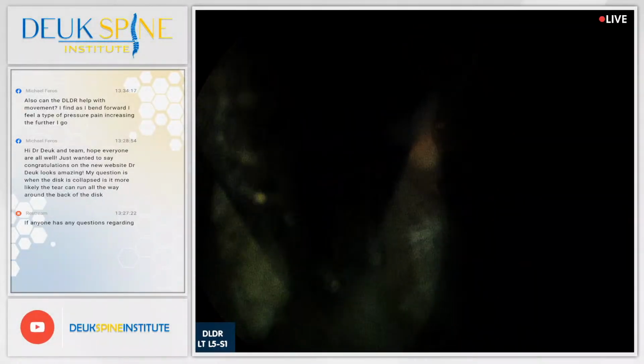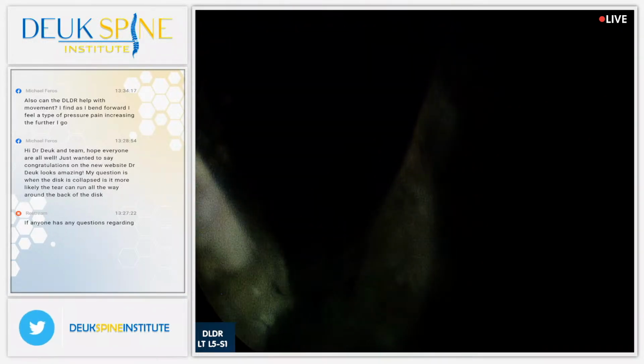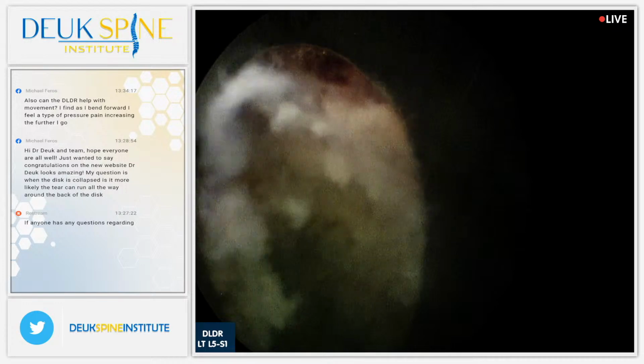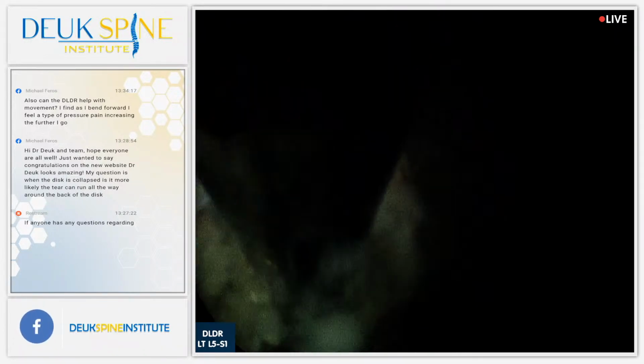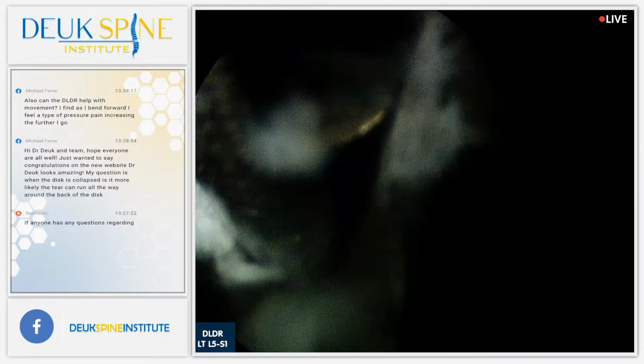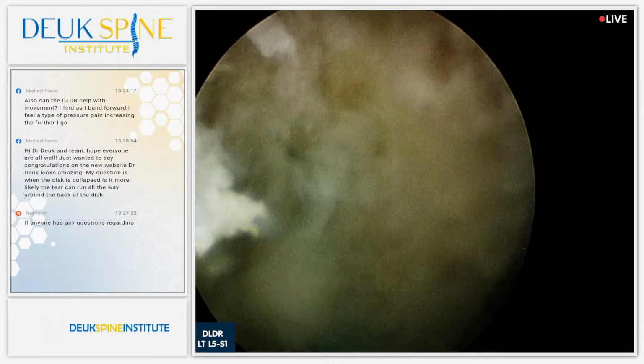All right, well, you show the audience the facet animation. I'm going to keep chipping away at this herniation. I'm almost done. I just want to make sure we're not leaving behind too much. I like to get about 50% or more. That's my goal.